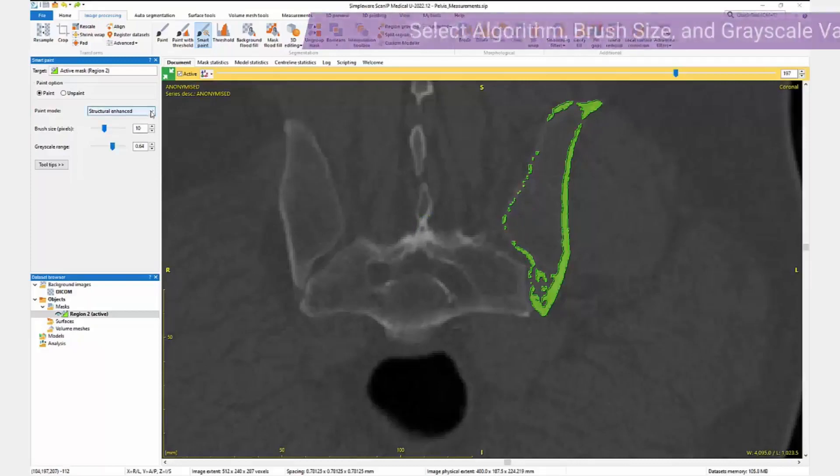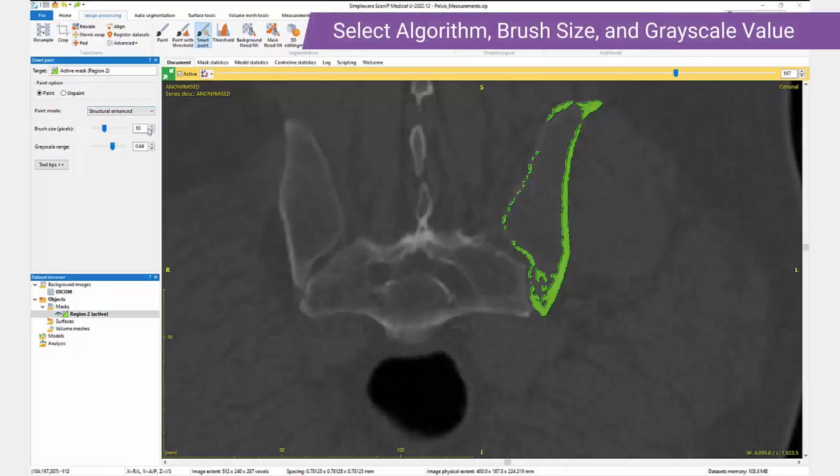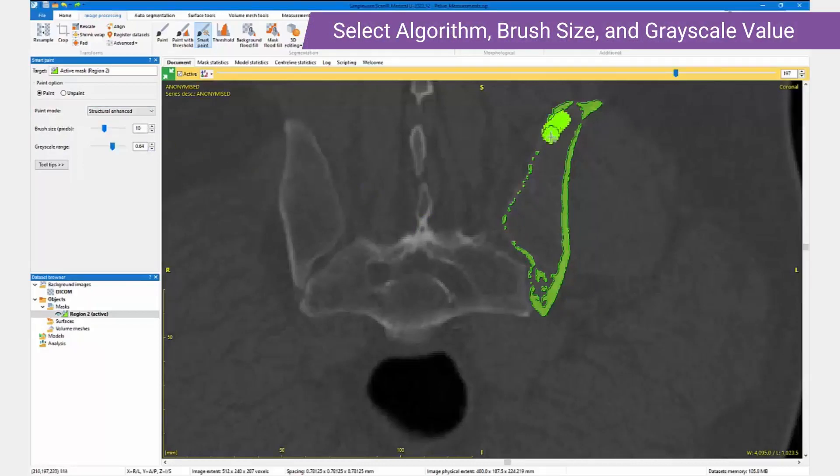We select an algorithm, a three-dimensional brush size, and a grayscale value to aid the separation of the foreground and background, and we paint in the active slice view.